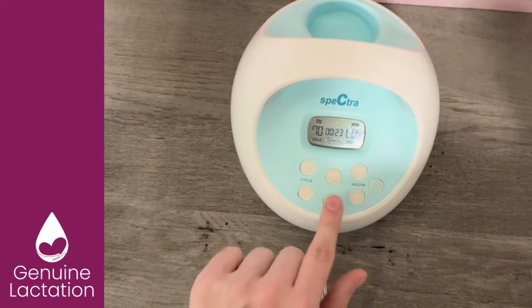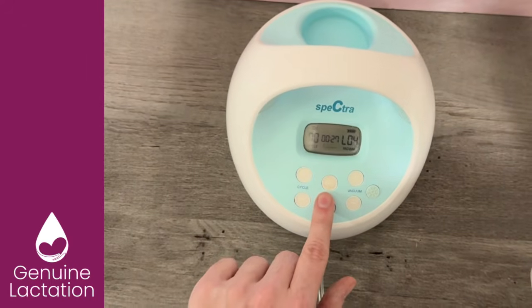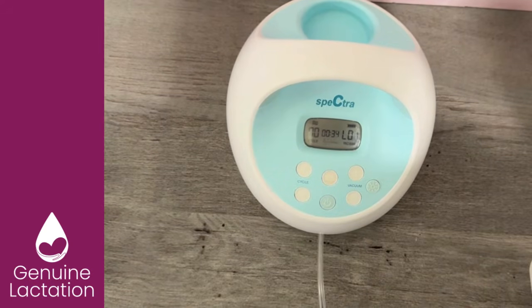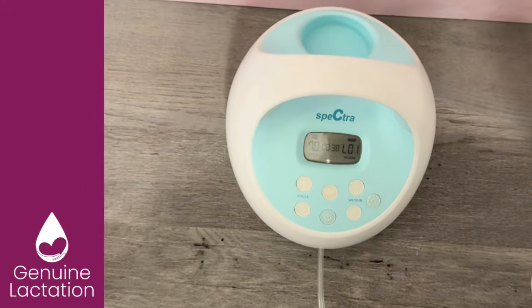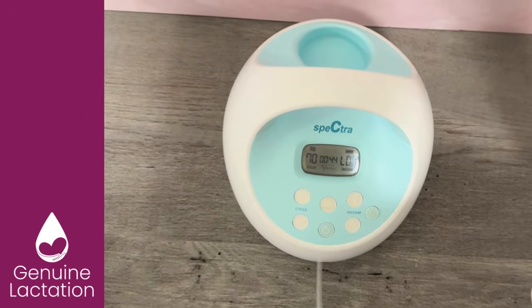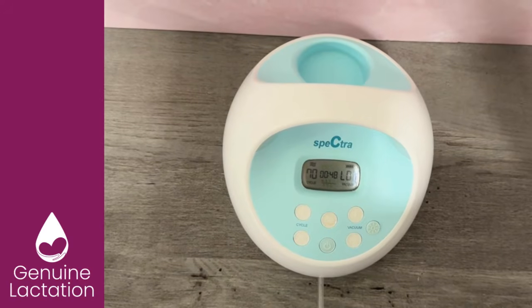You're going to hit the wavy line button up here, which is also affectionately known on social media as your bacon button. And what you're going to do is again turn this all the way down, because where you start in a pump session and where you finish may be two very different points. And with this vibration, sometimes we don't always feel exactly what's happening. So we may end up exposing our nipples to too much suction, which causes a higher risk of damage and doesn't actually typically improve our performance.